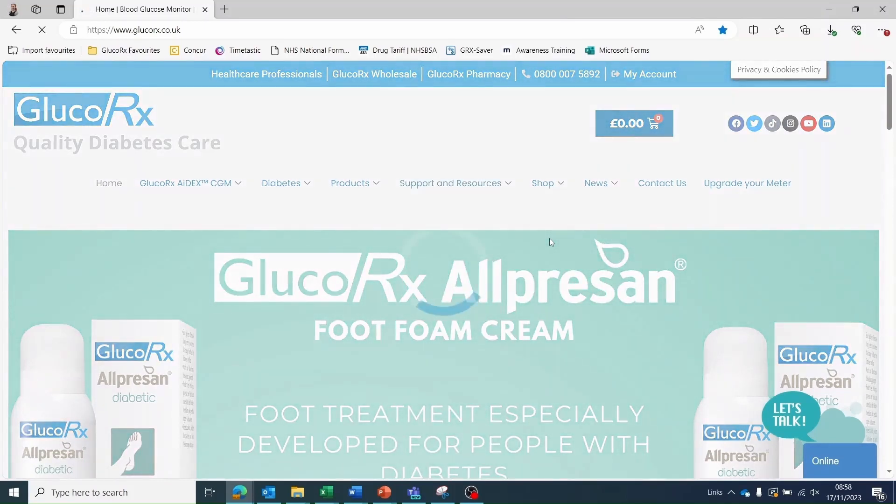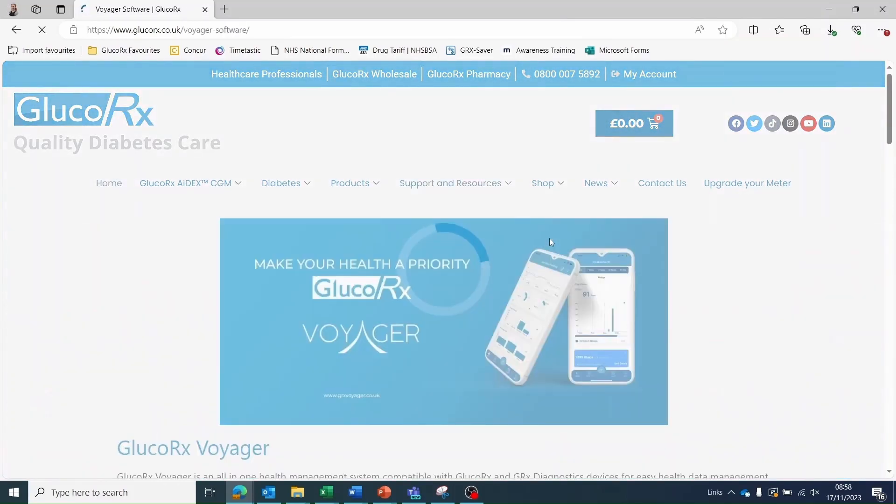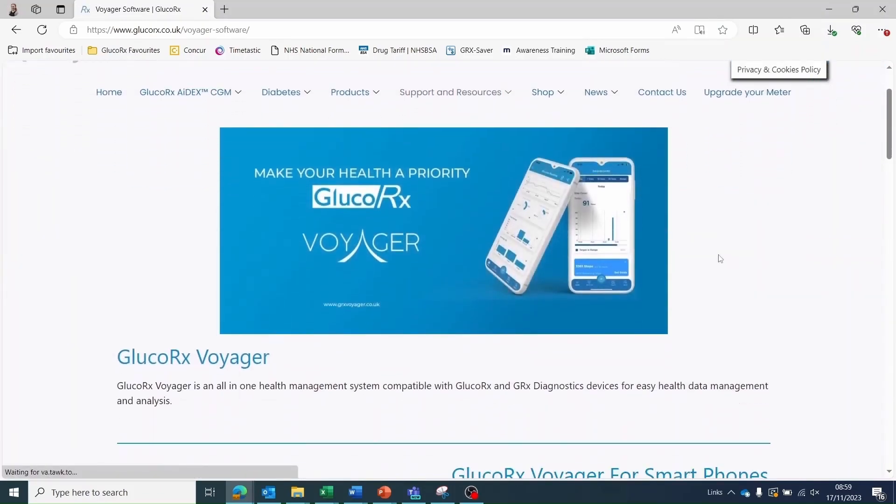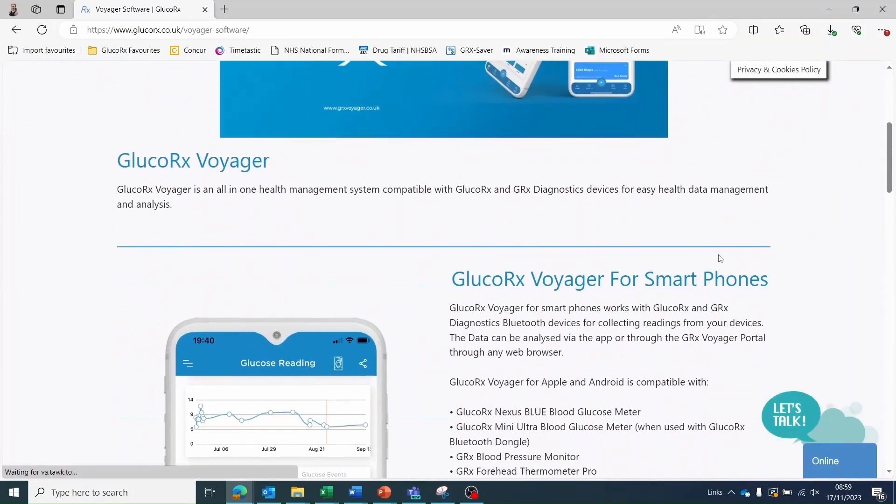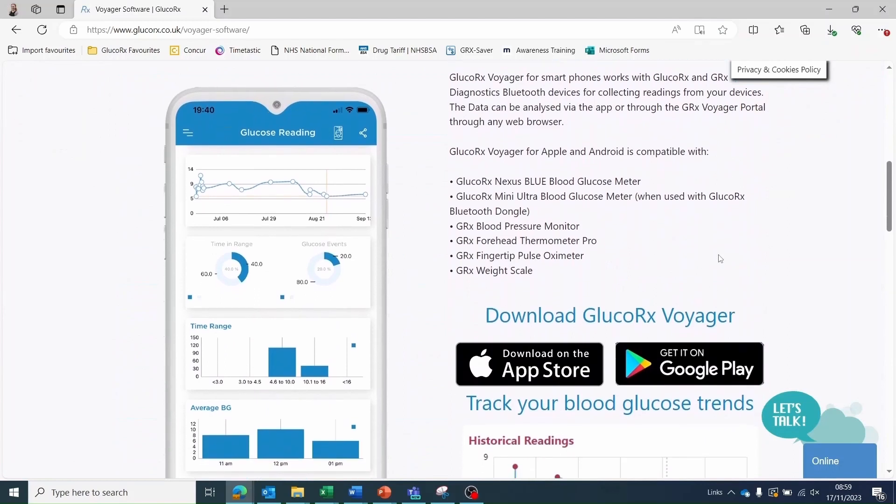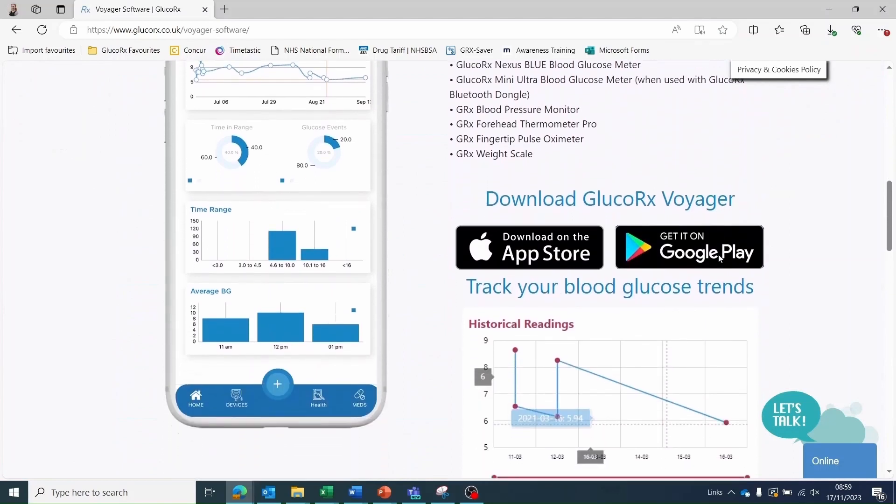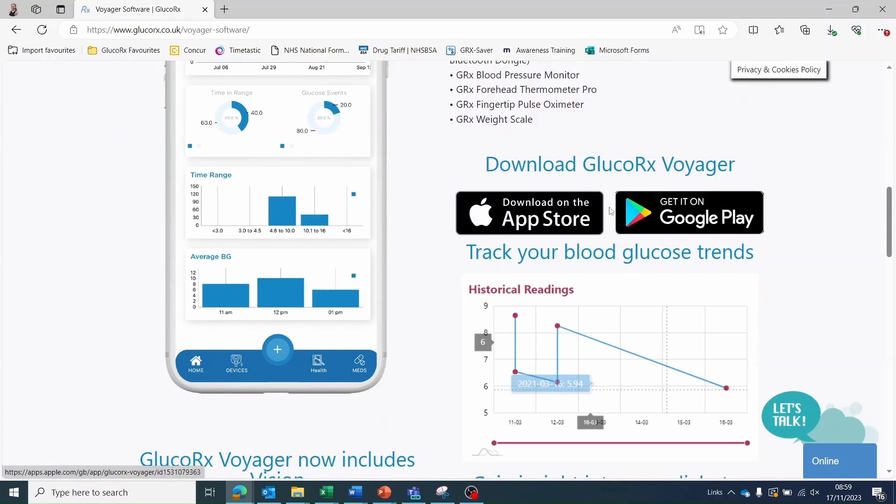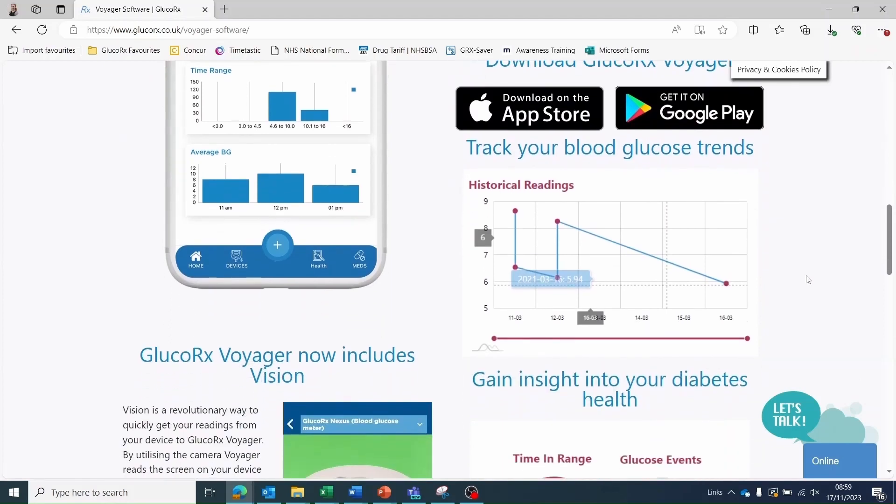This will direct you to the GlucoRx Voyager main page where you can find lots of information about the software. This page includes the links to download the GlucoRx Voyager app onto your smartphone. Select App Store if you're using an Apple device or Google Play if you're using an Android device.